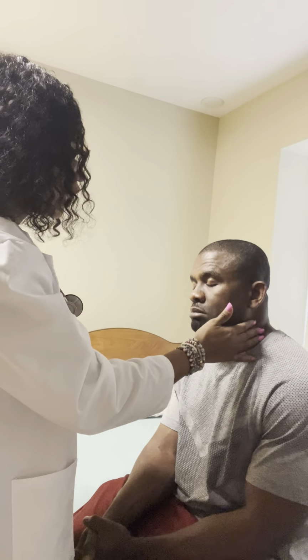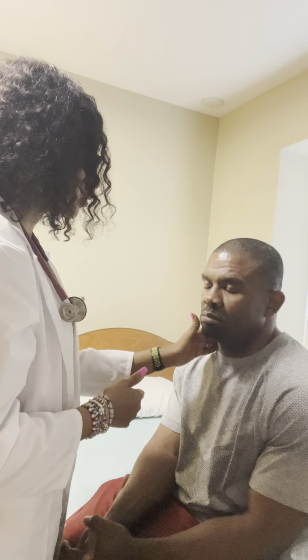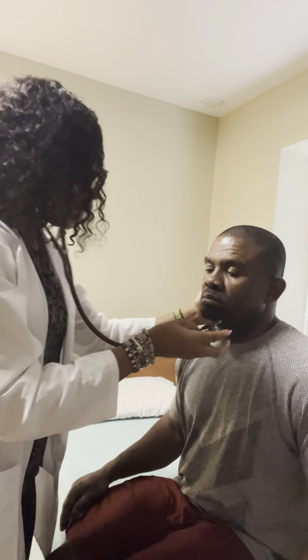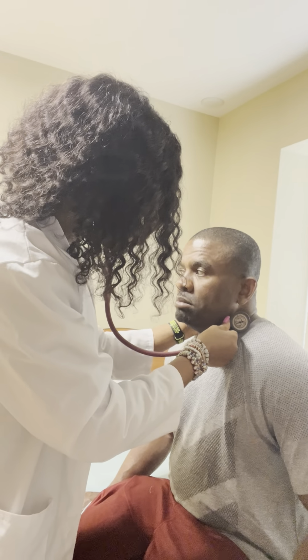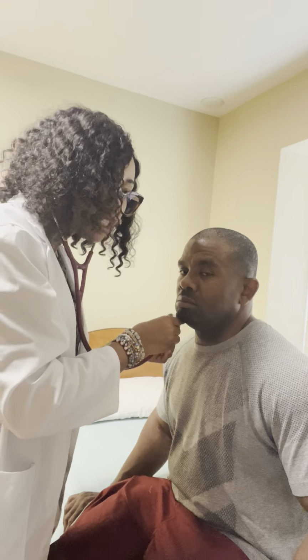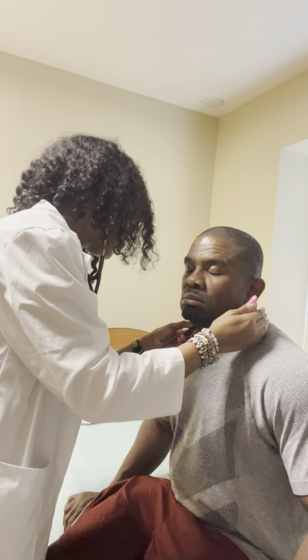Next, I'll be checking the carotid pulses, one side is normal and bounding and the other is normal and bounding. I will auscultate for bruit. I will use the bell of my stethoscope, and I'll have the patient take a deep breath and hold it. Good, no bruit. The patient holds their breath so that breath sounds do not disrupt the bruit sound. Take a deep breath and hold. Good. I did not hear any bruit.